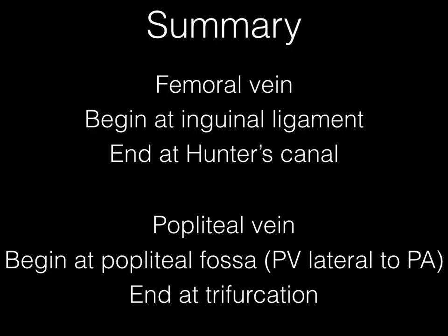So again, in summary, we want to assess that entire femoral vein. You want to start at the inguinal ligament and end at the Hunter's Canal for now. In terms of the popliteal vein, we're going to begin in the popliteal fossa when they're next to each other, and we want to end at the trifurcation.